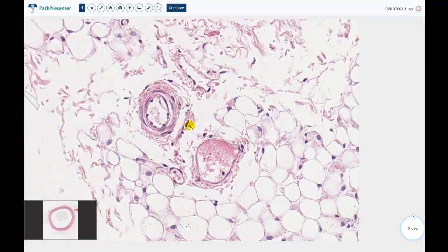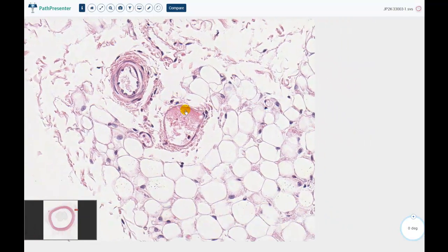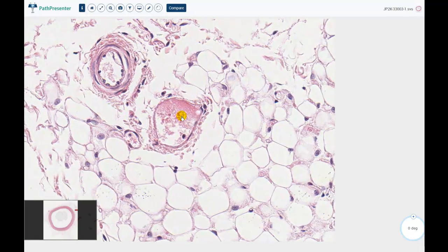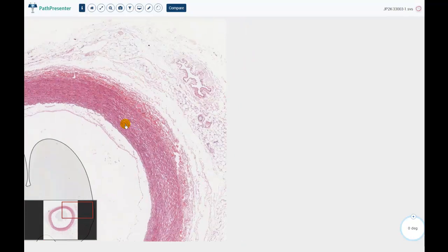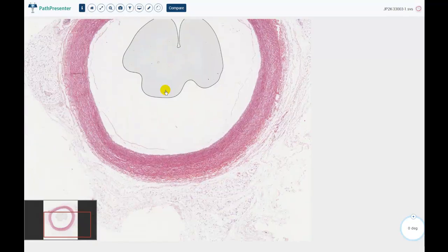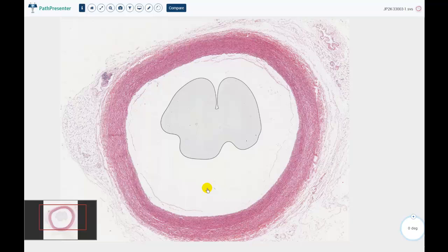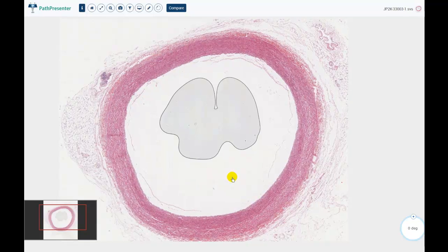Then I noticed here's a very small arteriole, only one, maybe two layers of smooth muscle around it, and there are cross sections of the endothelial cell nuclei. And just adjacent to it would be what I would classify as a post-capillary venule. Actually, it's a little larger than that because it has significant collagen around it for support. So those were very interesting observations, and it gives me the opportunity to demonstrate at least one artifact that occurs when one tries to mount a specimen on a glass slide.